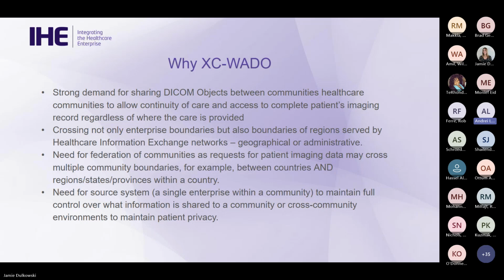But as you've seen for two profiles that were just presented, they're addressing very real needs in real environments. And so is this profile, which has been drawn on the strong demand for sharing DICOM objects between the healthcare communities, to allow continuity of care and access to complete patient's imaging record. This demand is coming from a variety of countries, a variety of environments.